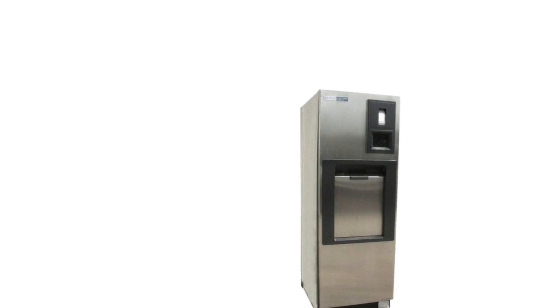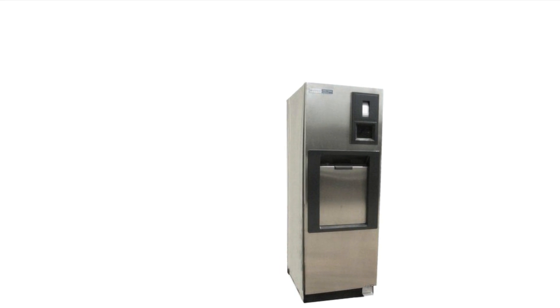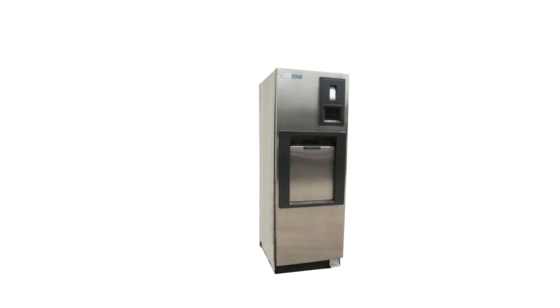The Steris AMSCO Sentry V116 is a cabinet-mounted stainless steel enclosure sterilizer. It features a touchscreen display, two shelves, and a vertical automatic door.